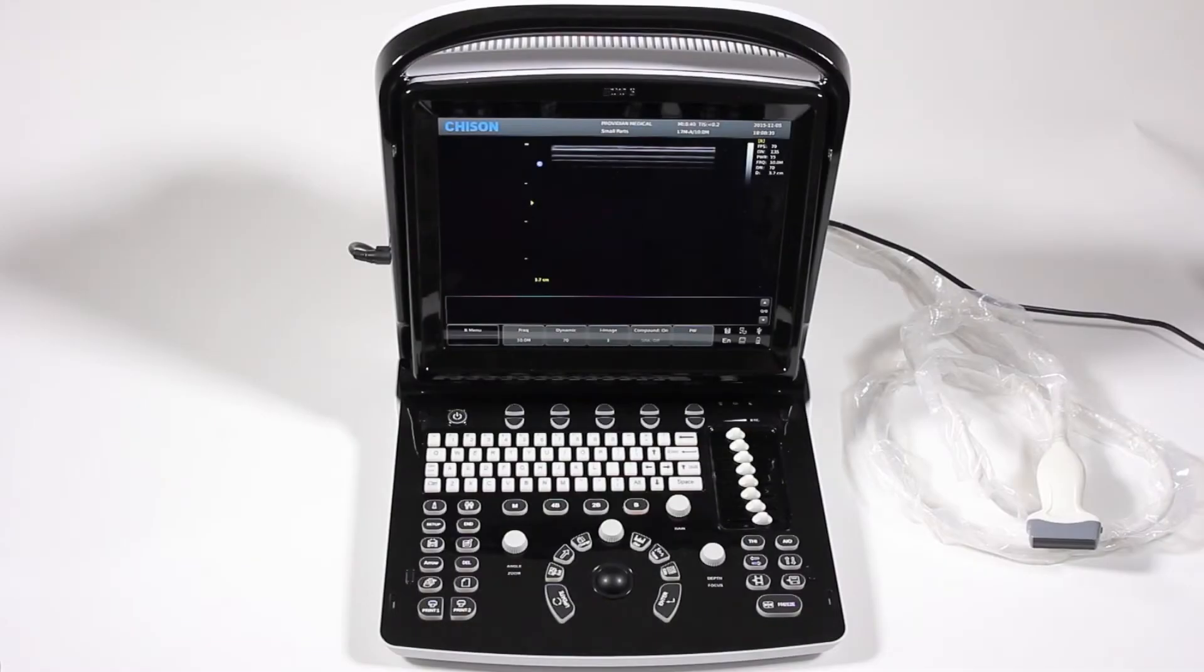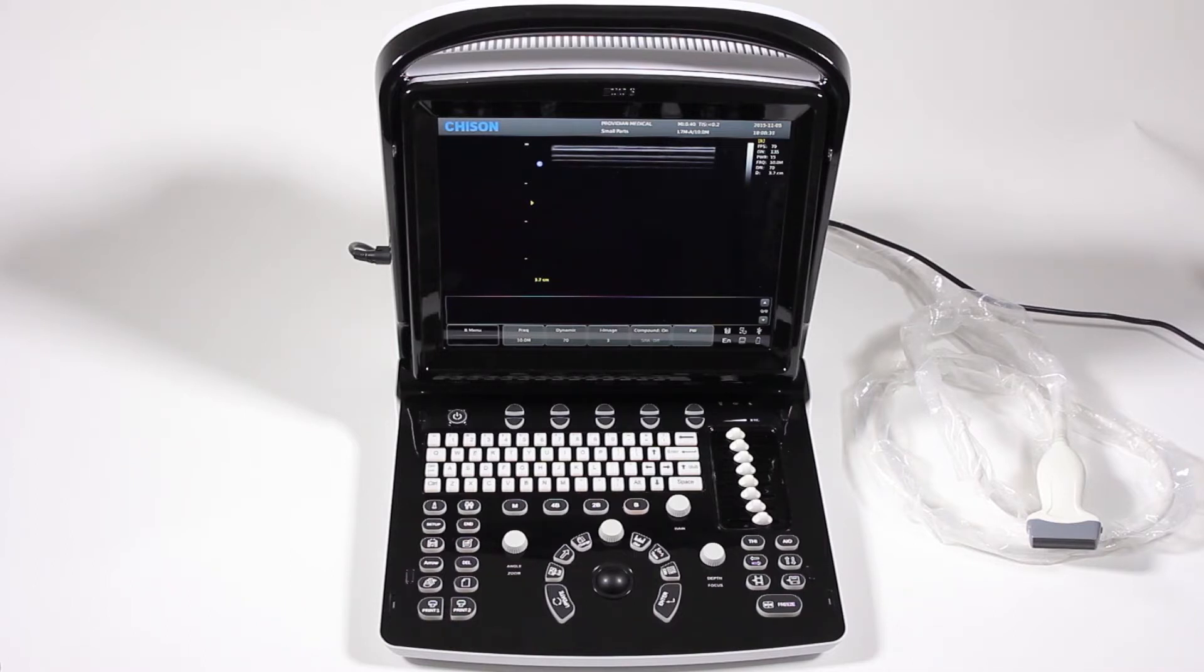Before we get started imaging with the ChaiSign Eco3, let's take a quick look at how the system works, where some menus are, and some things that may not be as obvious while you're scanning.